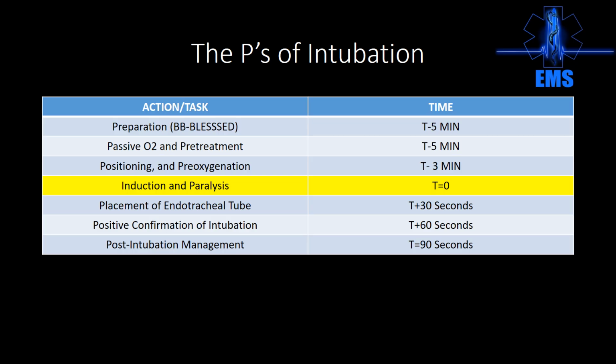The very first thing that goes on the patient is end tidal CO2, and we're going to look for that plateau end tidal CO2 readout. If we got a shark fin, we got a problem with what? Not oxygenation, but ventilation, and the patient is air trapping. That means we need to slow the rate down and provide deeper breaths.